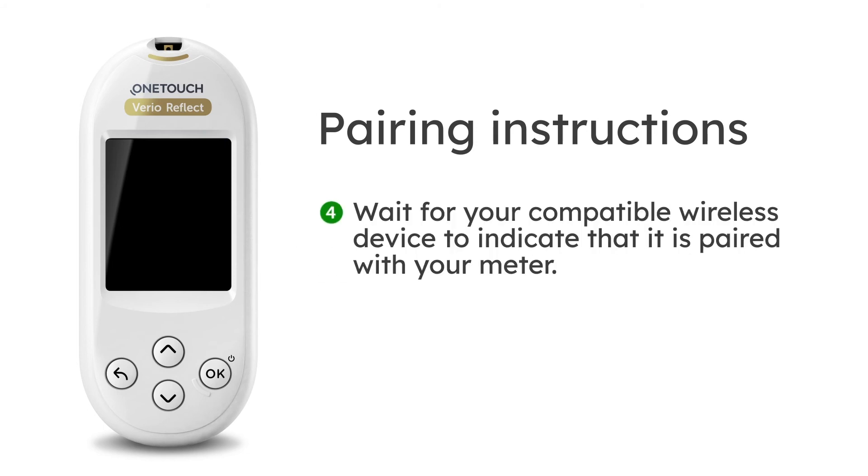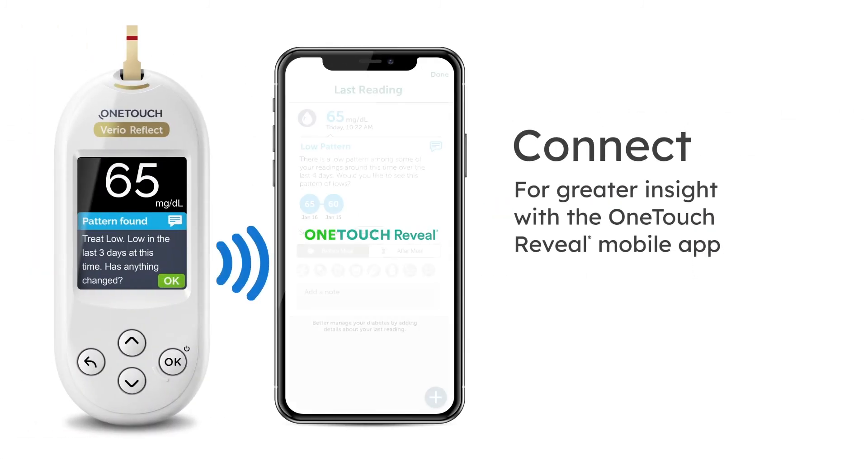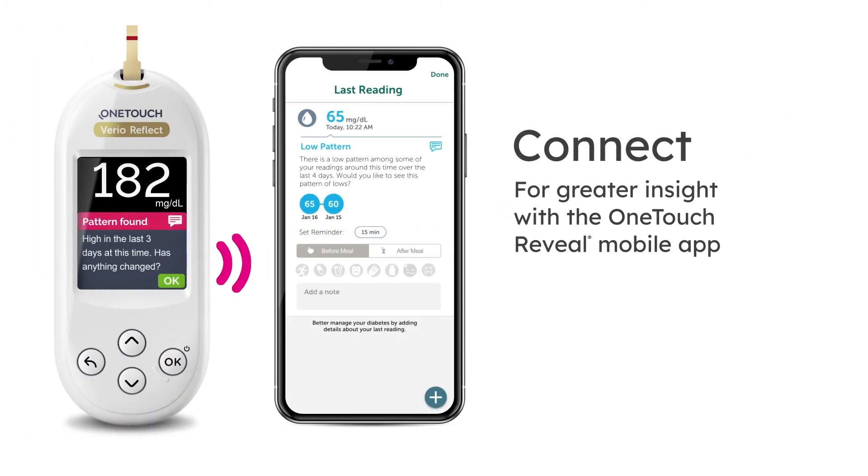Step 4: Wait for your compatible wireless device to indicate that it is paired with your meter. Connect for greater insight with the OneTouch Reveal mobile app.